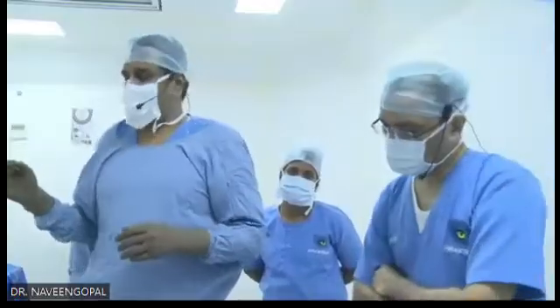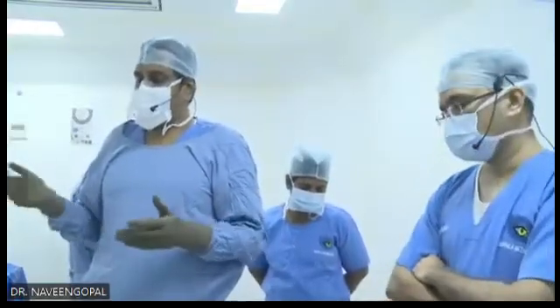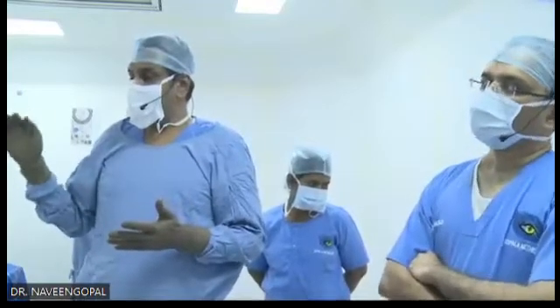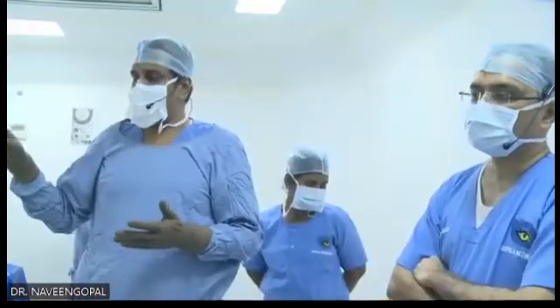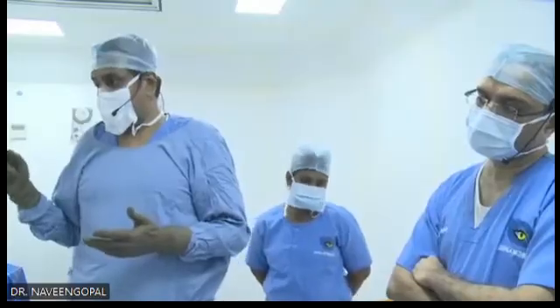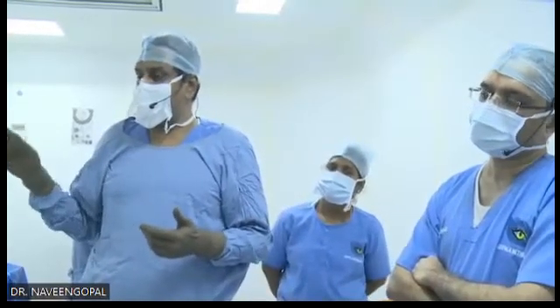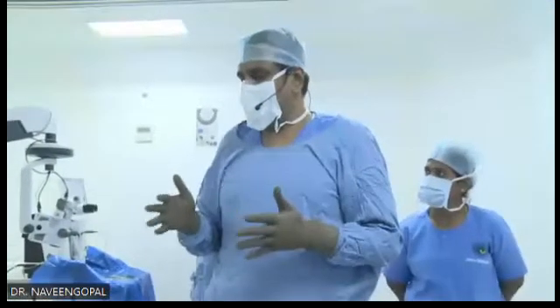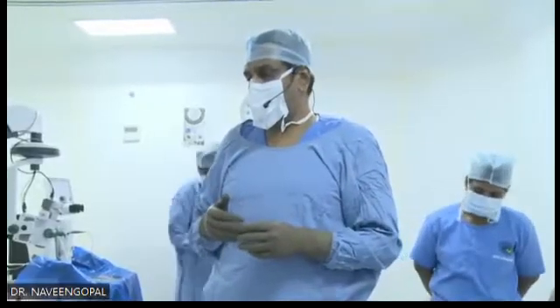They'll do the OBSCAN or Pentascan for you. You need an OBSCAN for your corneal thickness and for the ACD. Particularly the ACD, we can't calculate. Rest everything we can calculate with whatever machines we have. But ACD from the endothelium we cannot calculate. For that we need corneal thickness and the ACD, which is measured only in Pentacam or OBSCAN.